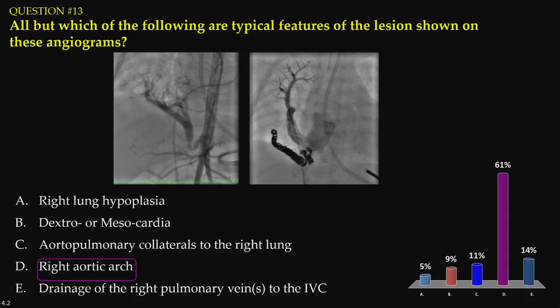So sometimes you have a segmented portion, or sequestered portion of the right lung in particular, and you have an aortopulmonary collateral that's supplying flow to that. And you can see on the angiogram to the right, that's been coiled off by the time they took that angiogram. So this is scimitar, and it's associated with right lung hypoplasia. The heart then moves over towards the right side of the chest because of that as a secondary phenomenon. It's associated, as I said, with APCs to the right lung.